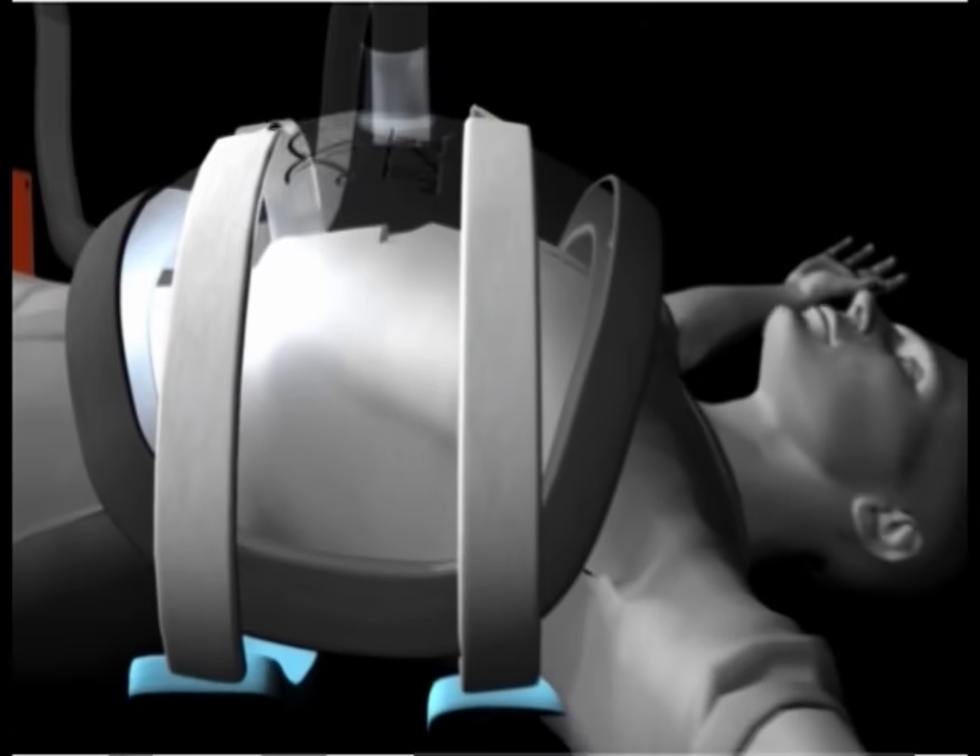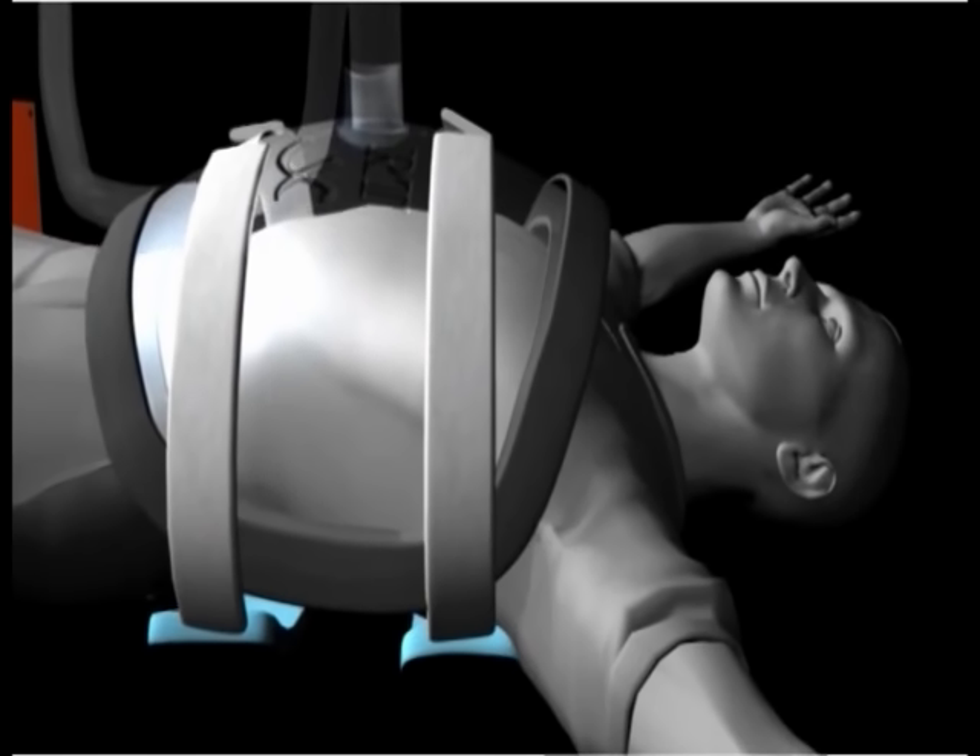Using positive pressure in the cuirass, it then creates an expiratory phase — exhalation.